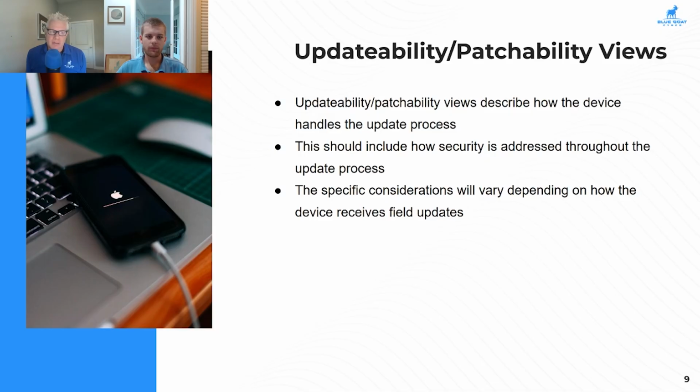Yeah, I remember one of our clients there, as you mentioned the infrastructure that supports the over-the-air update. They had their over-the-air update infrastructure connected to their corporate environment, which obviously is not a secure updatability or patchability environment, because the HR person is sitting logically on the same network as the person that's developing the update. So that's one of the things we have to consider if we do an OTA, right? Definitely. We want to make sure this is an isolated process outside of anything else.